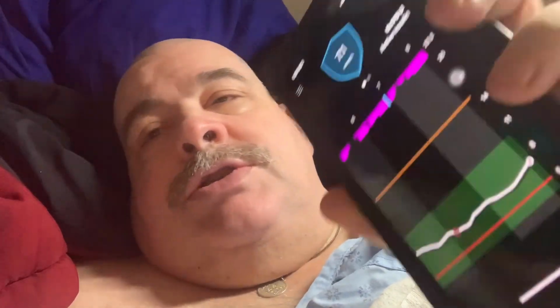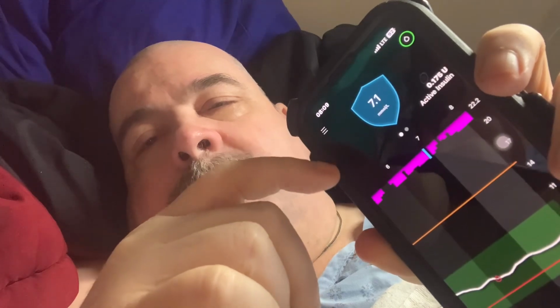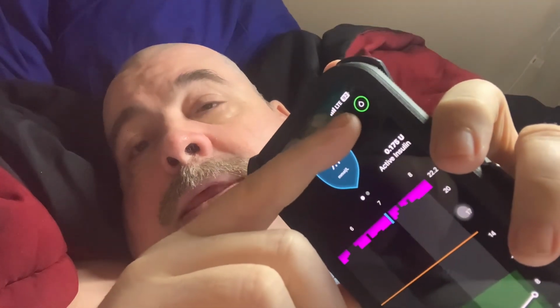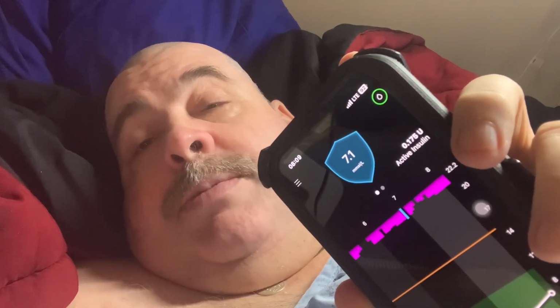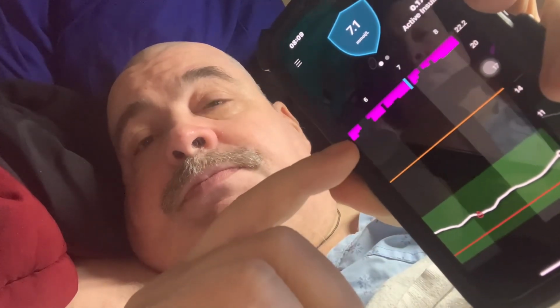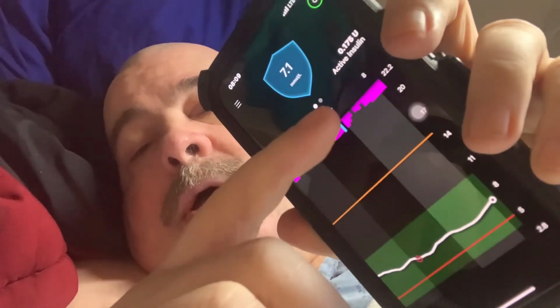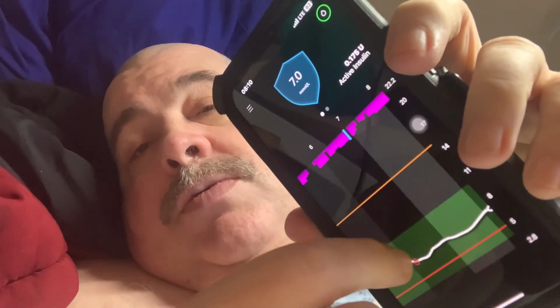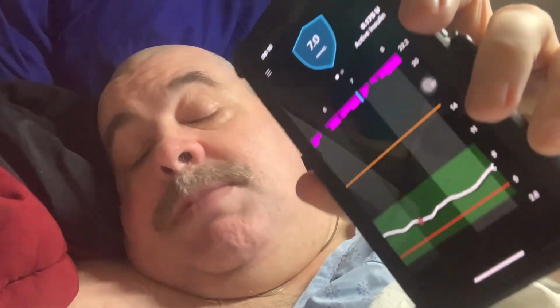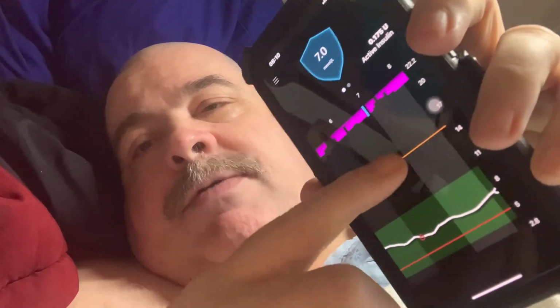But let's go on and do blood sugars. Current blood sugar 7.1. Sorry, we showed that last time. We are currently calibrated. We had one correction. So, I don't know, maybe we'll get another. But right now, don't necessarily have one.